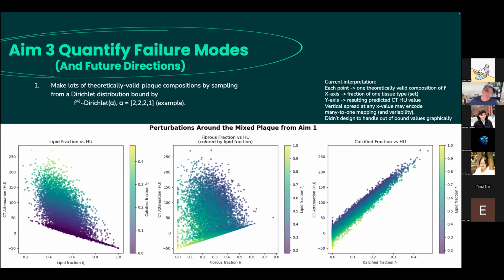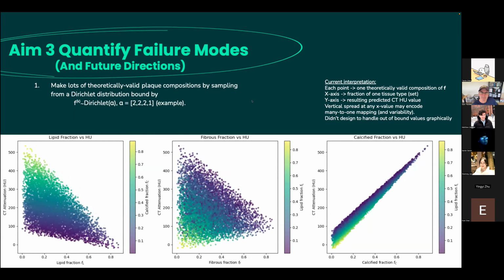So, if you just go across the CT attenuation range, you'll see that there are definitely some crucial areas that were being interrogated before, and they're just absolutely full of points. So that alone, you can see how it could be confusing for the computer. Moving forward, back to return to the nice version and then forward again.